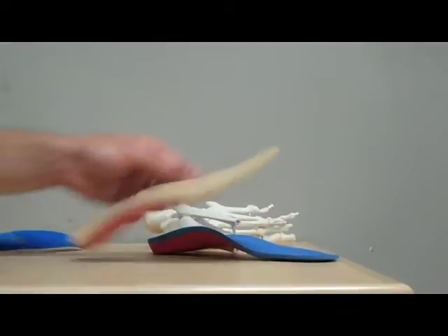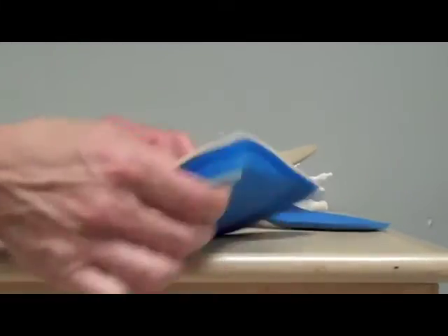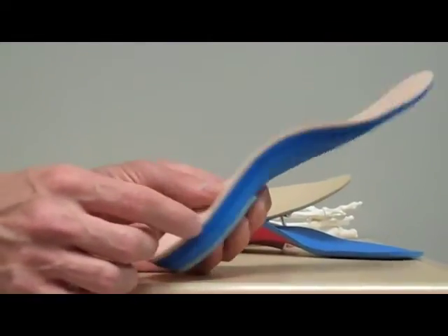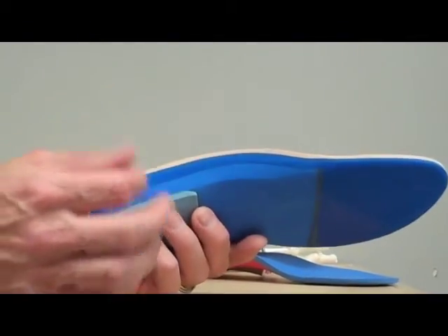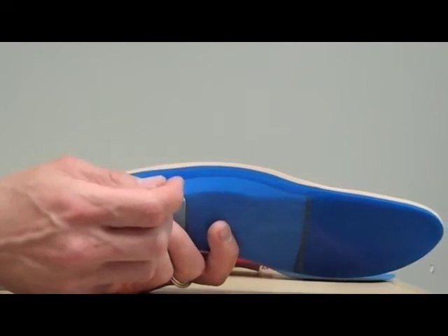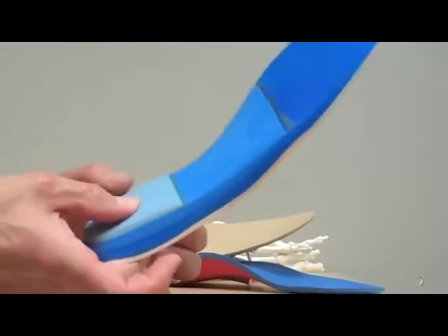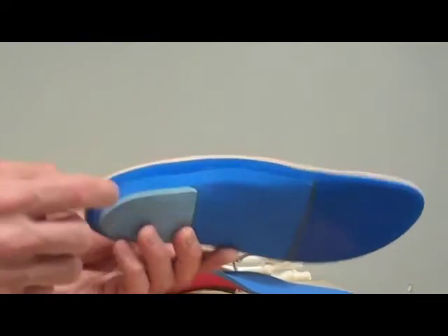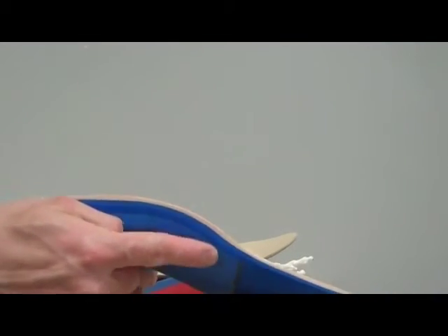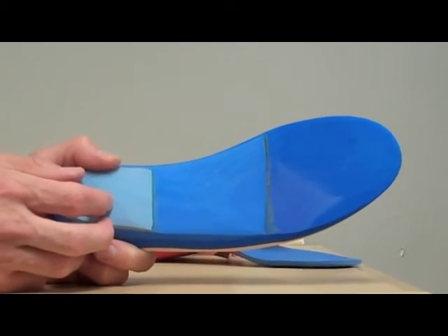And then lastly, some people do fine without anything fancy, and they want something that's softer against the heel. So we go with the softer material, P-cell. That's a lighter durometer foam that's softer. Go with a middle layer of Poron, which is a material that doesn't bottom out. It never thins down. And then go with a nice heel pad. And inside here, what I do is I grind down the top cover that I mold to the foot, and put another layer of this stuff so they're really soft through here. And then same thing, hug it up against the midfoot, and none of the posting that we did in the other two.